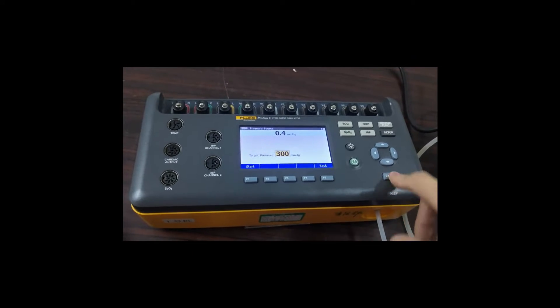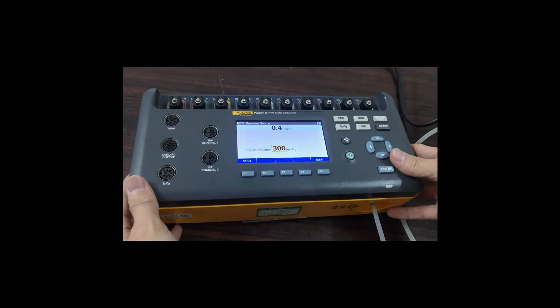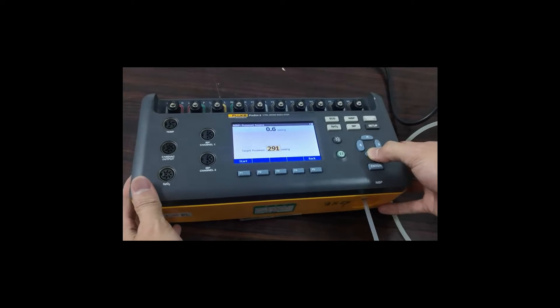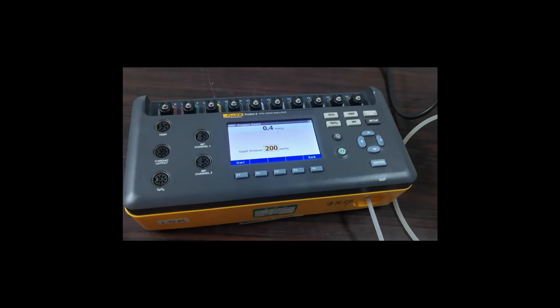And set the target pressure to 200 mmHg.